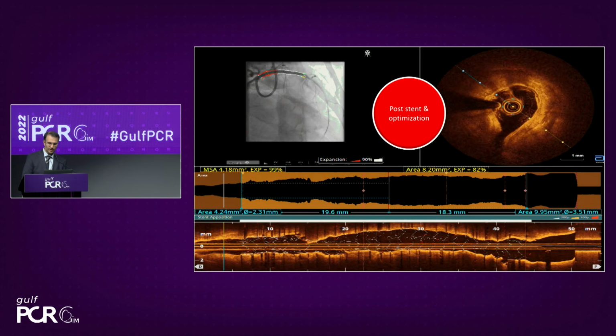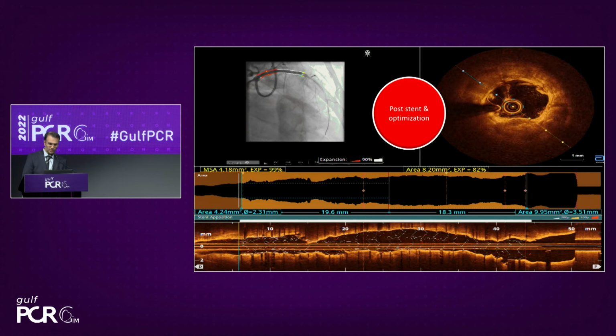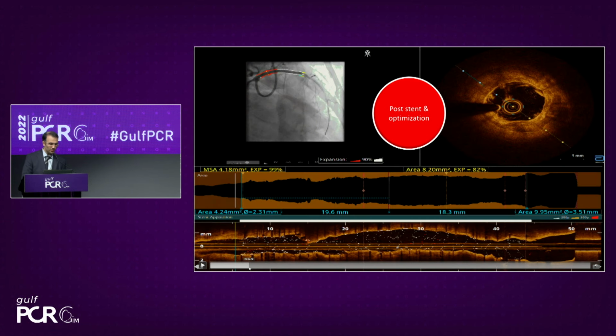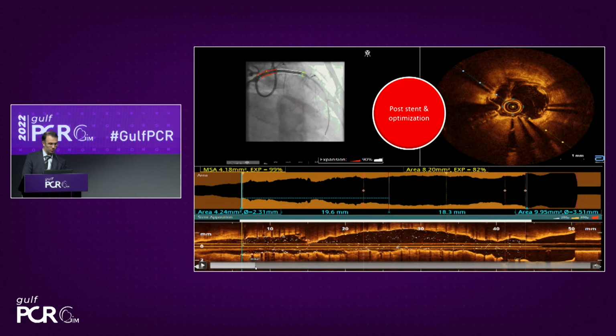So we are running again distally, which I initially did not intend to treat, and then I got the distal part of the stent. I'm going to get you back, because here we have to remember the MLD max. So we've done with the MLD, now it's the max part, so the M of any medial dissection. This is the distal part of the stent. The stent looks to be relatively well opposed, and there is no edge dissection.